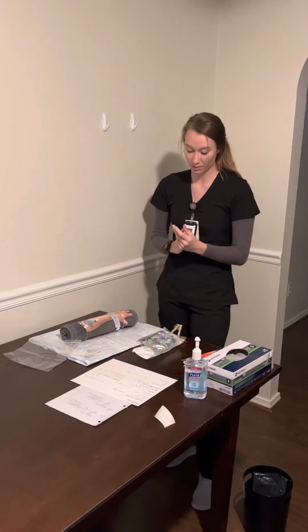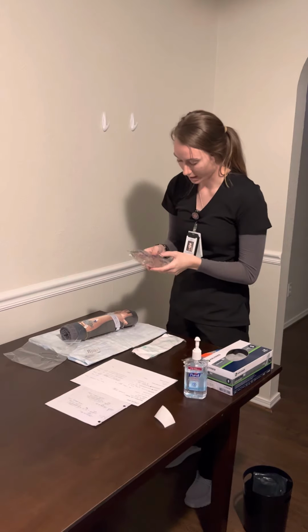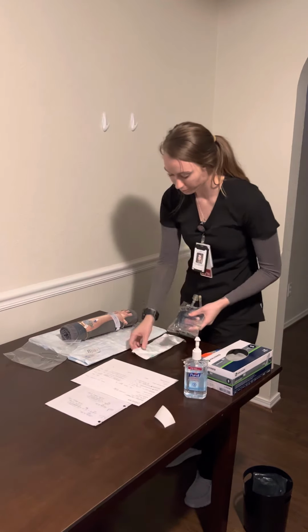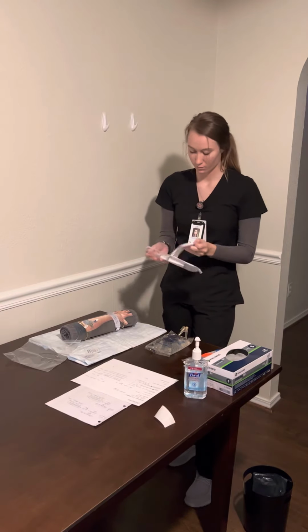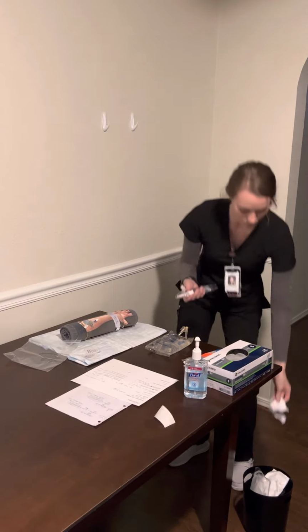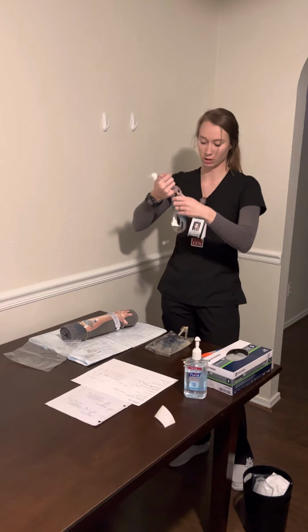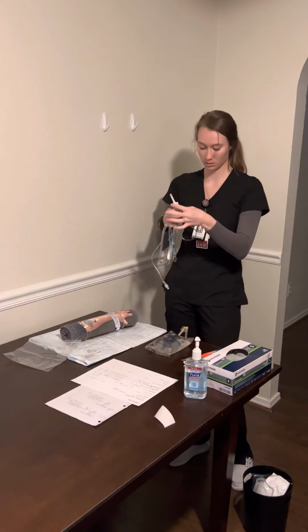So I'm going to begin preparing the primary infusion of normal saline. With my third check, I have normal saline, 500 milliliters, and sodium chloride, 500 milliliters. So I'm going to get my tubing. I'm going to make sure that my roller clamp is closed. All right, so that is closed.